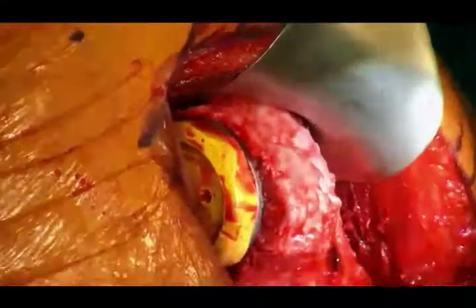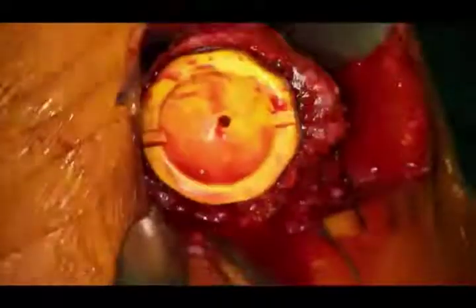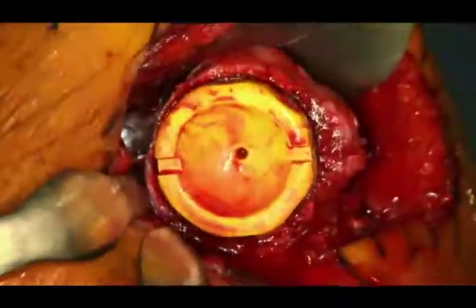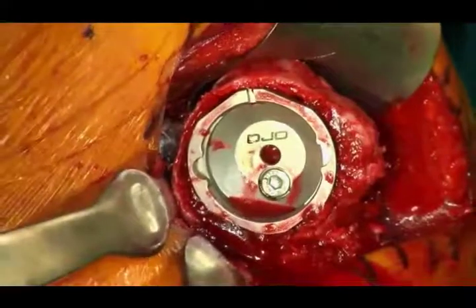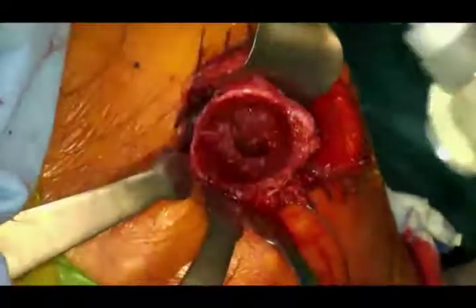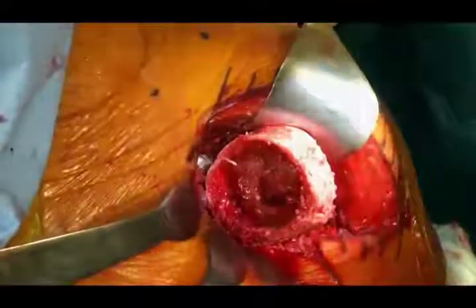I'm putting sutures in now. I'll do four sutures up and down. He doesn't have great subscap so I'm not going to start too high — just a bit lower. Some surgeons like Howard Routman say don't repair the subscapularis at all. But new studies are looking at advantages of repair, and it's also implant-design specific. I think repair does diminish your dead space — the early French studies had a high number of hematomas, likely because they didn't repair anything.